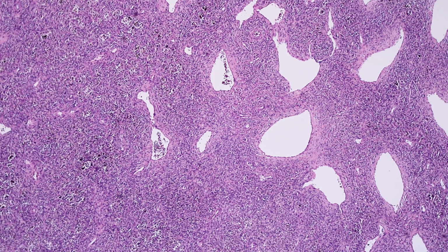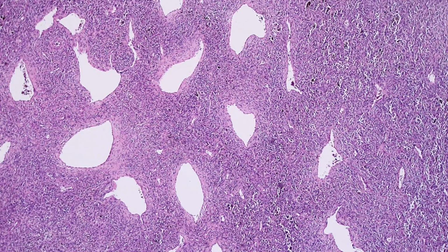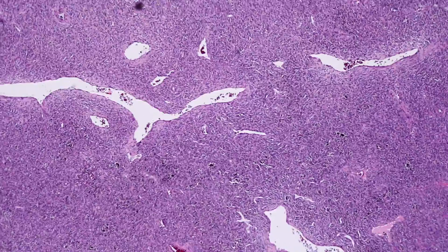It can be seen in big dermatofibromas. It can also be seen in dermatofibrosarcoma protuberans, particularly the fibrosarcomatous form, and many other tumors beyond that. All right, so in this cellular area, you can see that it's very cellular, it's very dark blue, and it goes down a long ways into the deep dermis and even into the subcutis.